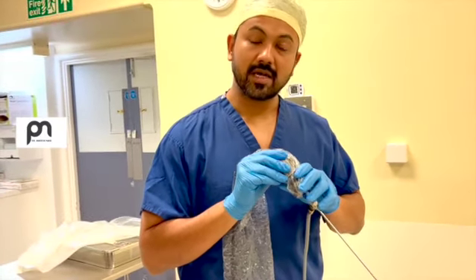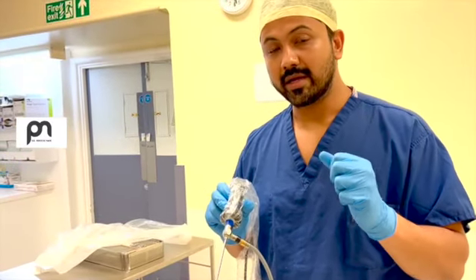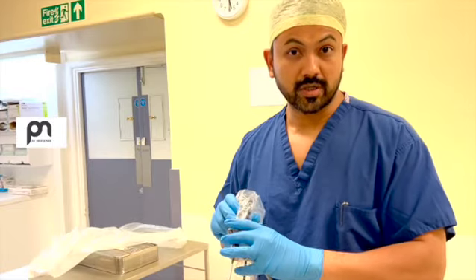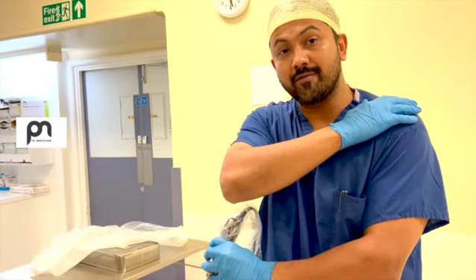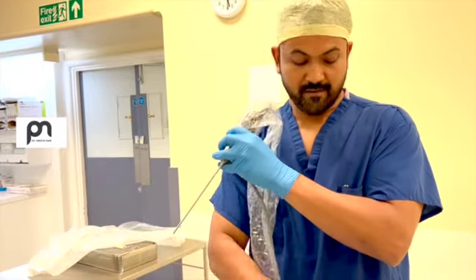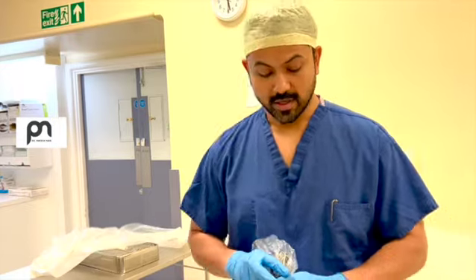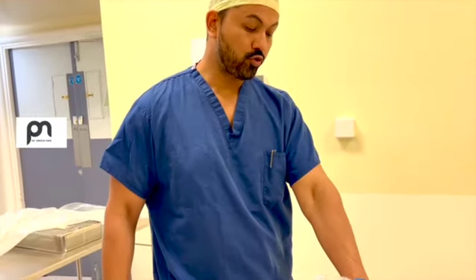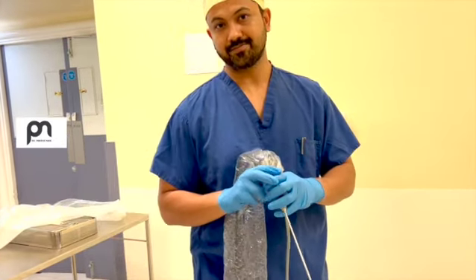Ultimately, the main thing is that you should not have cramp when you're holding, after holding for long. It should not hurt and you should not get pain on the elbow and shoulder. For that reason, when you're doing the surgery, it should be in the neutral position. It should be neutral, not too high, not too low, neutral position. You won't have any problem.